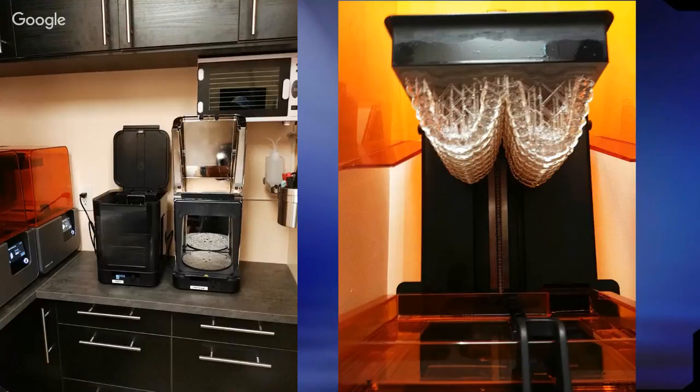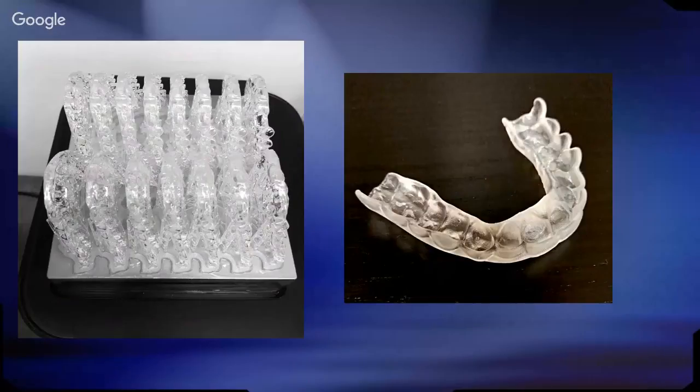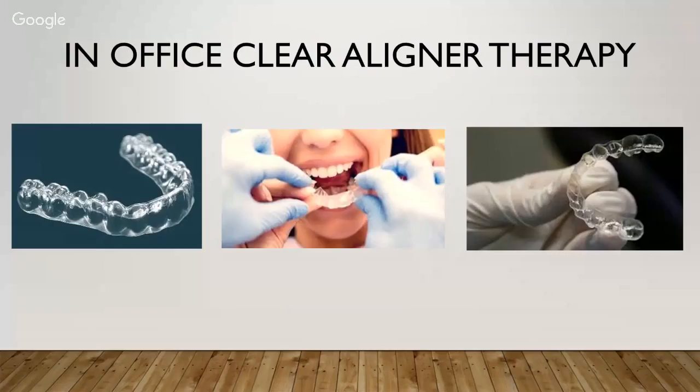We actually converted a little closet into a 3D printing center, and you can see some of the night guards here. We were actually printing these for a course, so it's not like we print this many night guards at one time, but they're very nice. And we print these at 100 micron accuracy, so you're saving time on the printer. You don't have to print down to 50 micron with these.